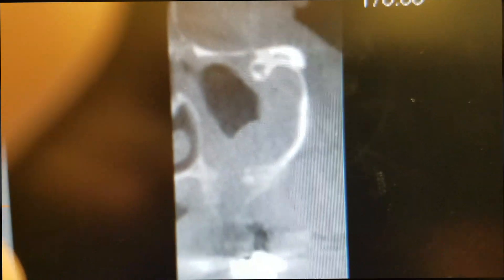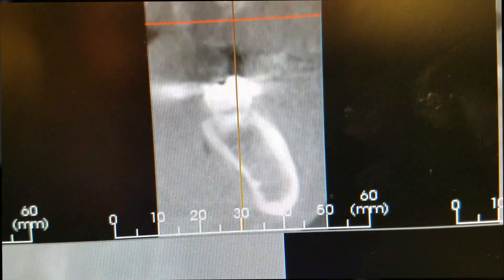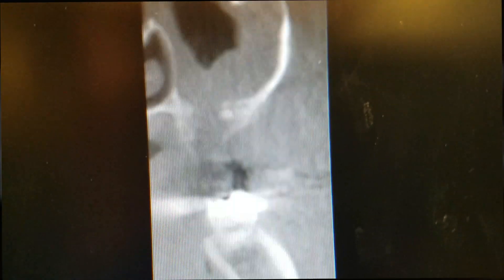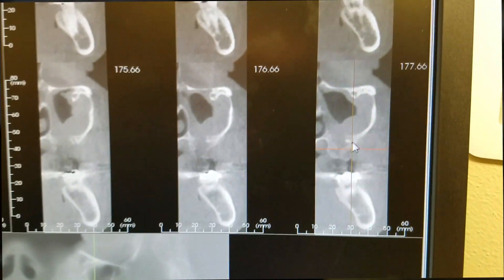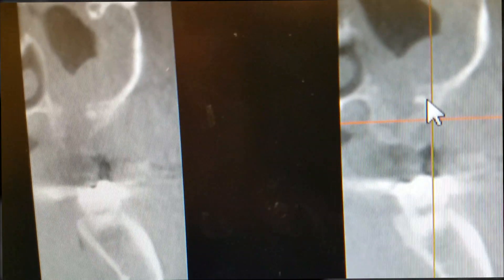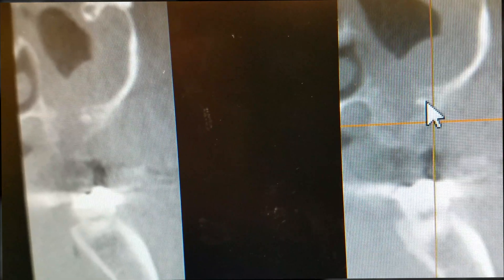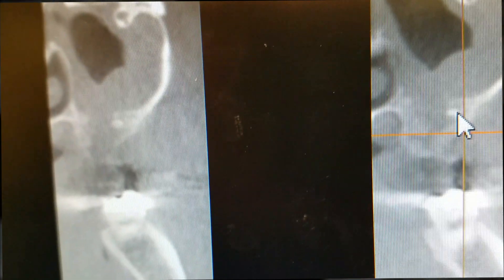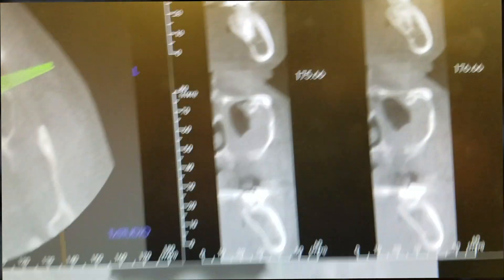If you take a look in this cross-section you get a hint — right there, there we go. There is a little root tip left in there. So what you're going to see is opening this area up and retrieving that root tip.